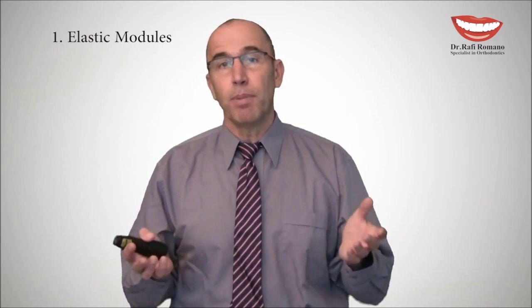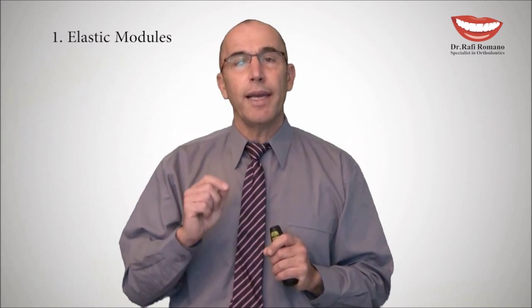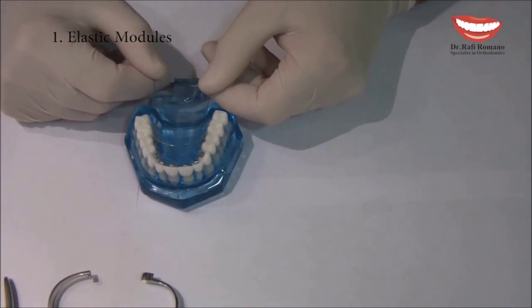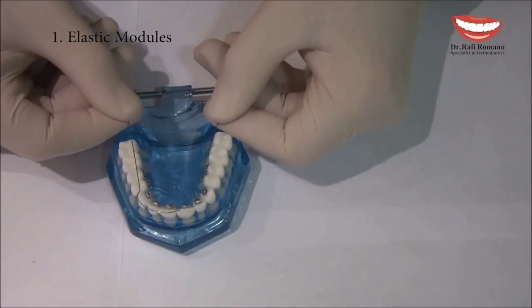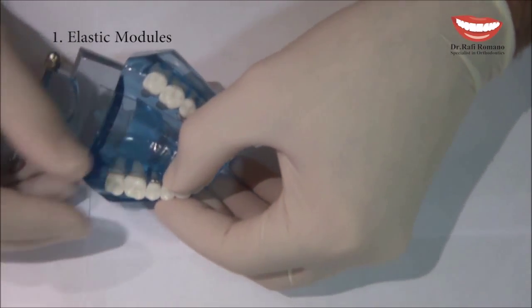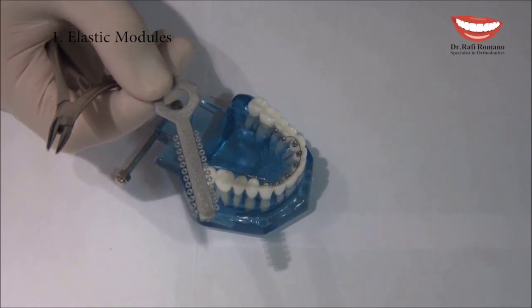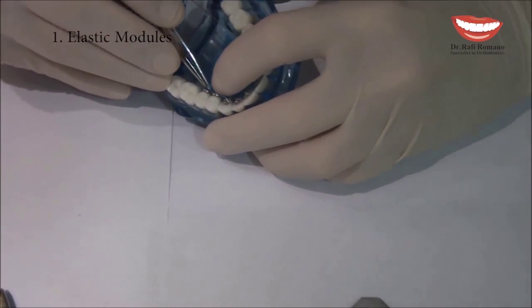The first technique is elastic modules — a very simple procedure which all of you probably do on a daily basis in buccal orthodontics. We will show you tips and tricks for working with these miniature brackets, which are very small and sometimes require accessories to ligate properly in the mouth. To do the elastic modules ligation, first we prepare the mushroom wire, which can be passive or active if we want to procline or expand. I start from putting an elastic module on the posterior teeth.